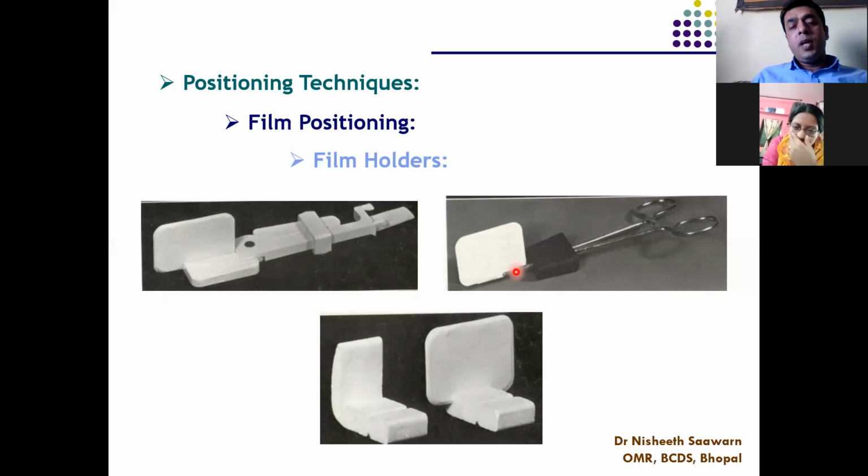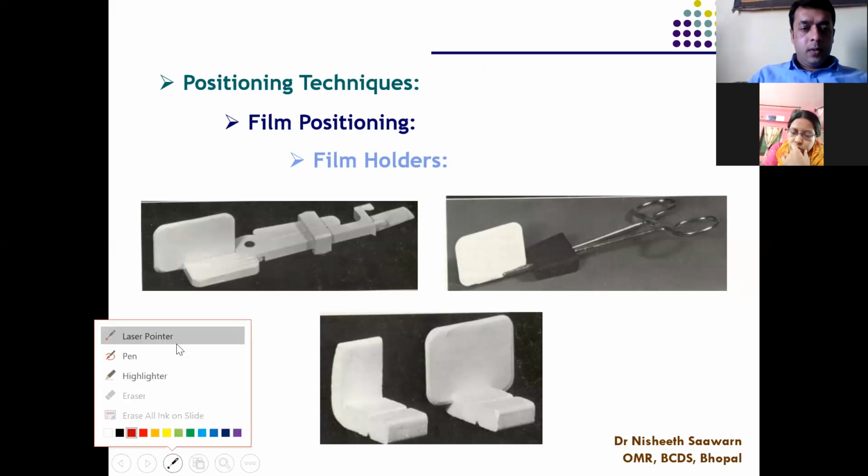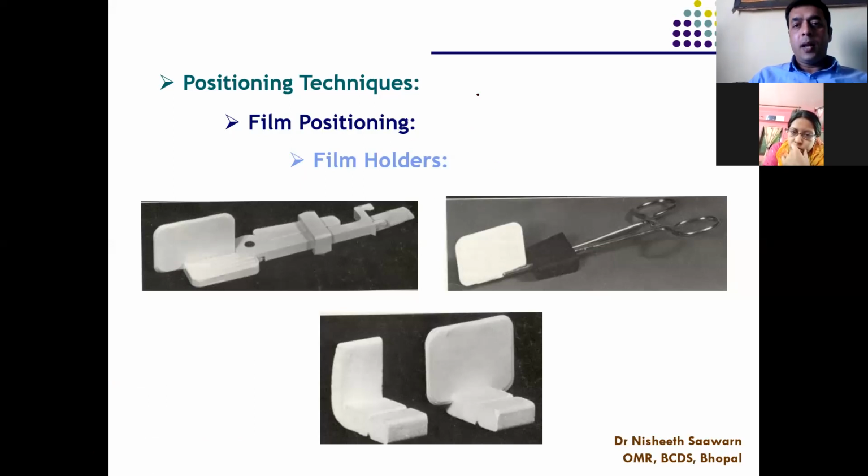अधिकतर लोग फिल्म के लिए पेशेंट के फिंगर्स यूज करते हैं, but we should not use fingers because if you use fingers you are exposing the fingers of that patient to the radiation, and radiation should be avoided as much as possible. पिछली क्लास में पढ़ा कि radiations are very harmful. So there is a technique called the ALARA principle.